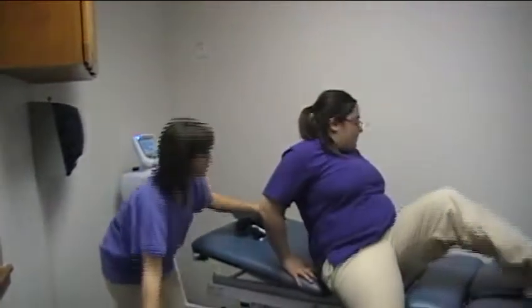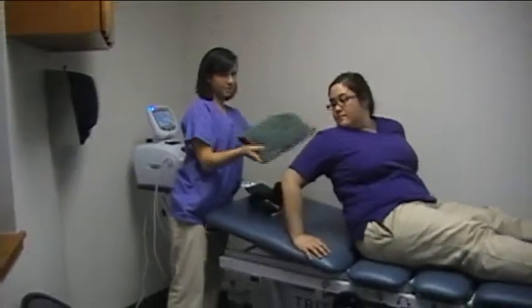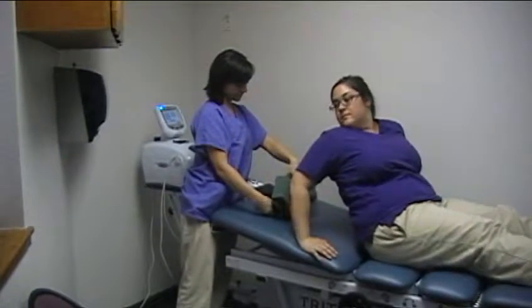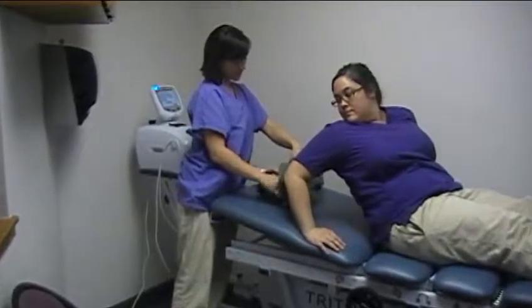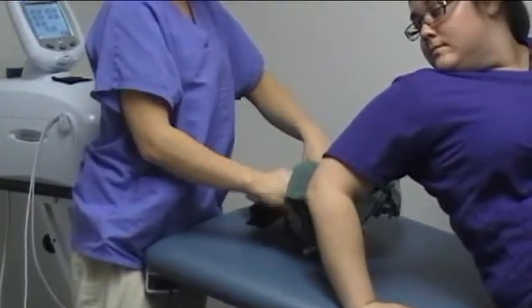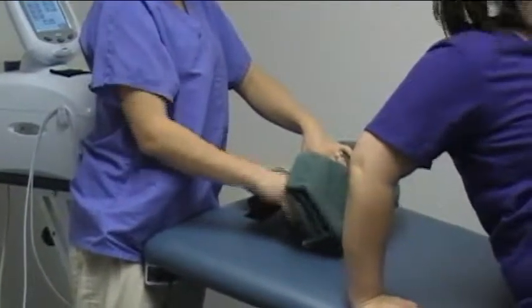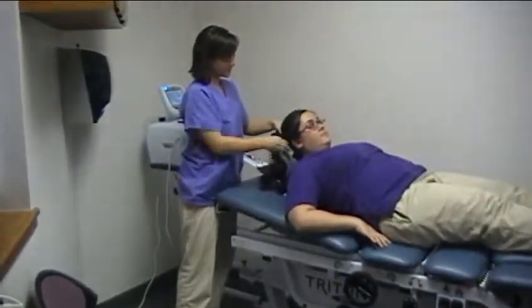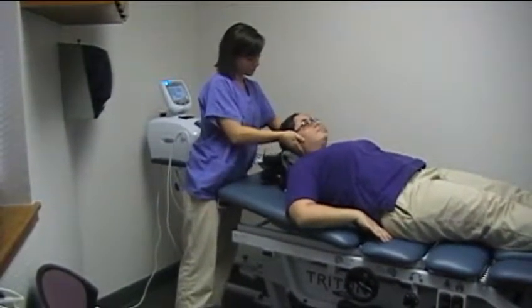Have the patient come over and slide on the same way. You also want to make sure that you put a towel around the cervical blocks, because it adds some extra comfort and support. Have the patient lay down and you want the base of their neck to be right in the middle of the blocks.